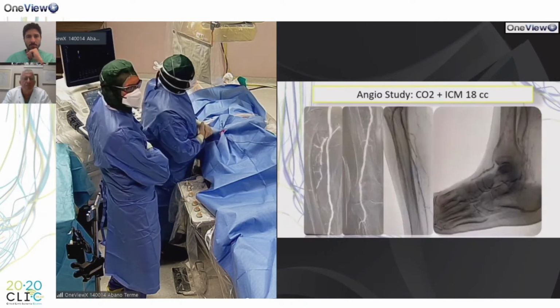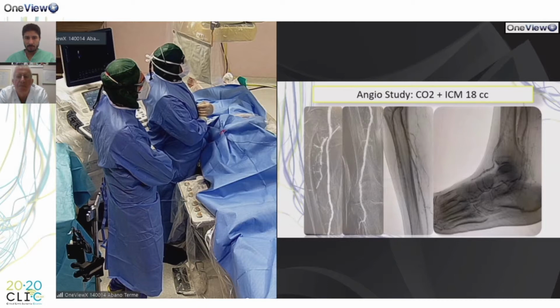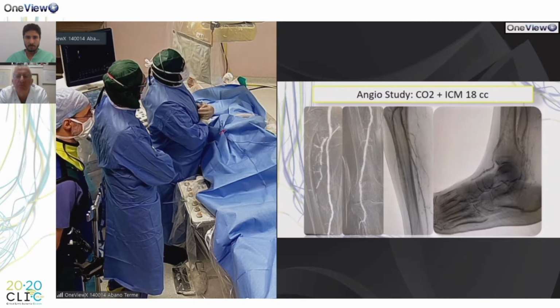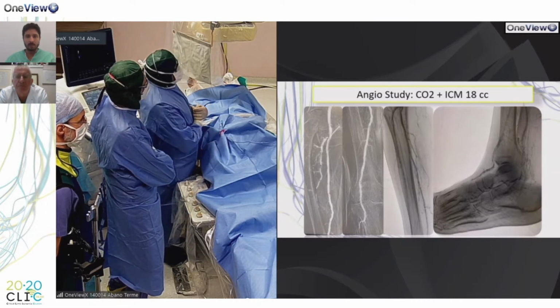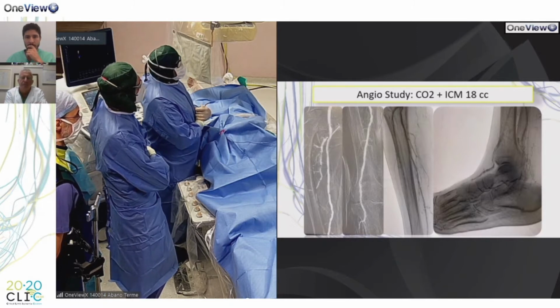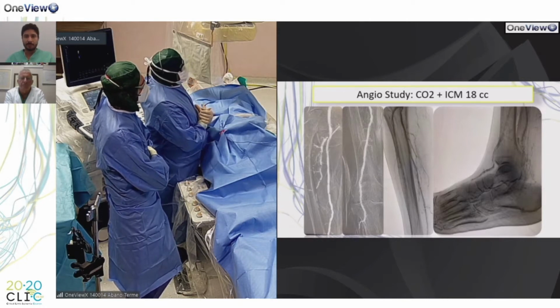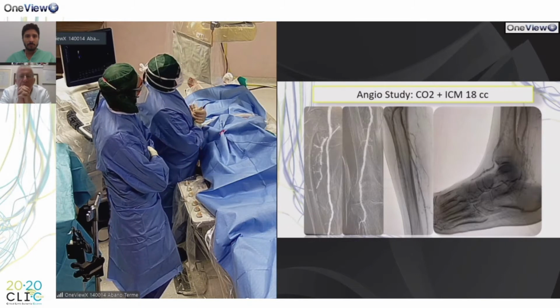The next slide, please. In our previous study, you can see the CO2 angiogram demonstrating a quite patent SFA axis, severely calcified, of course. Probably there is an eccentric plaque between P1 and P2. And the problem is below the knee, with an occlusion of AT and distal posterior tibial occlusion, and the aspect in the foot is not so clear, but probably we have to try to recanalize the tibial vessel arriving in the foot.